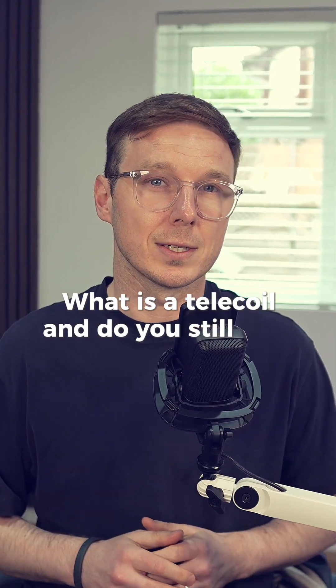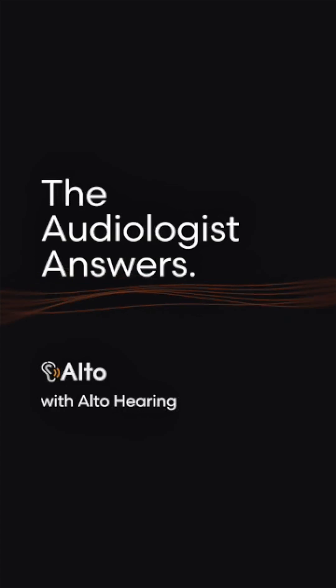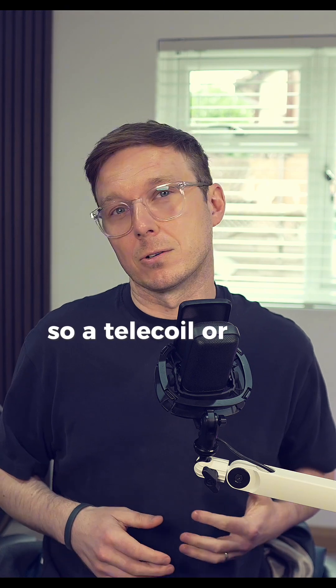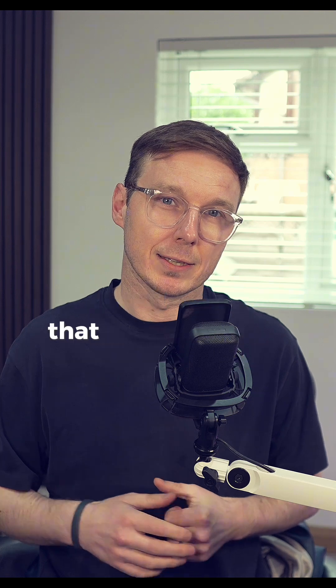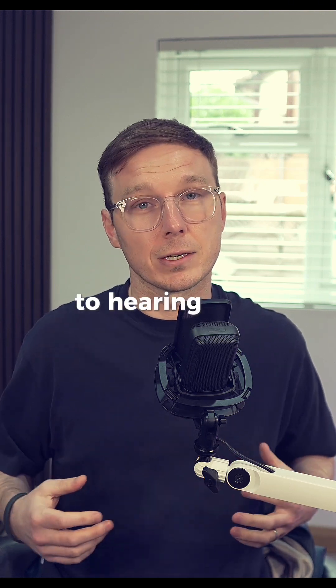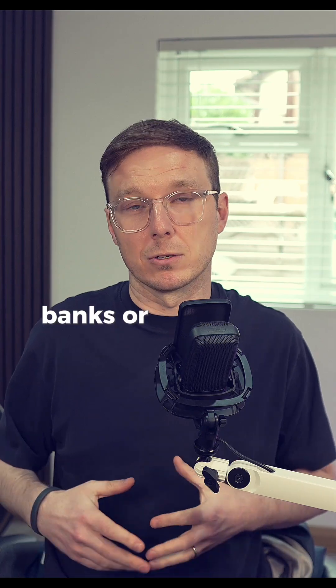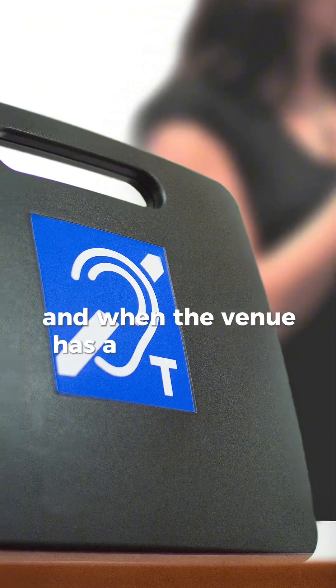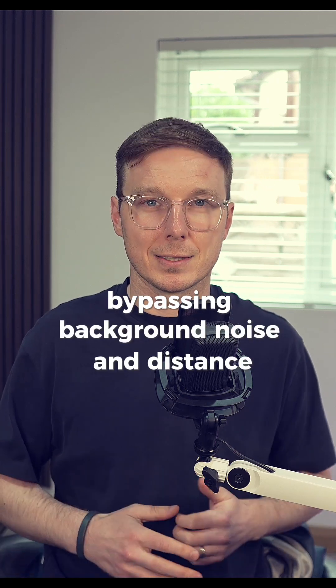What is a telecoil, and do you still need one in 2025? A telecoil or T-coil is a small wire loop built into some hearing aids that lets you connect to hearing loop systems in public places like churches, theatres, banks, or community halls. When the venue has a loop installed, your hearing aid picks up the signal directly, bypassing background noise and distance.